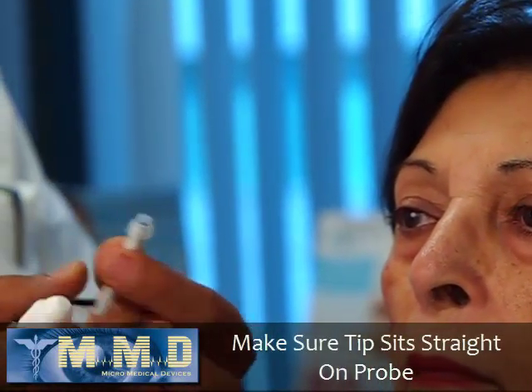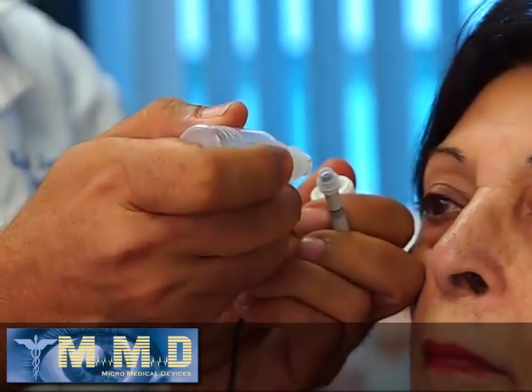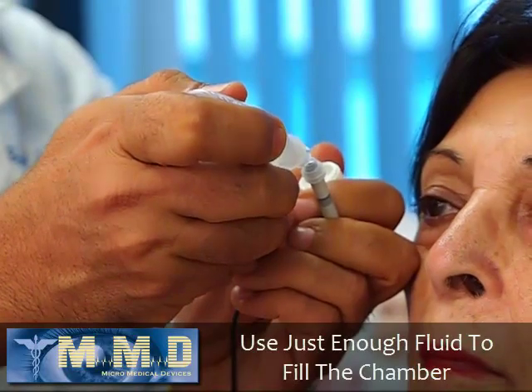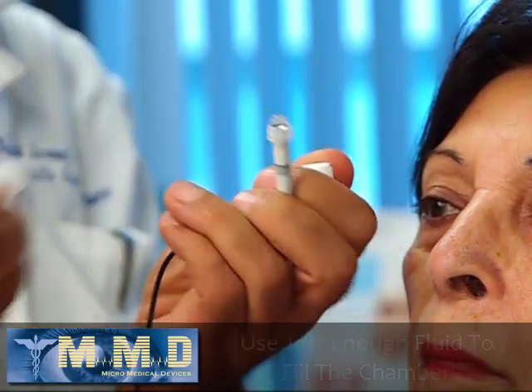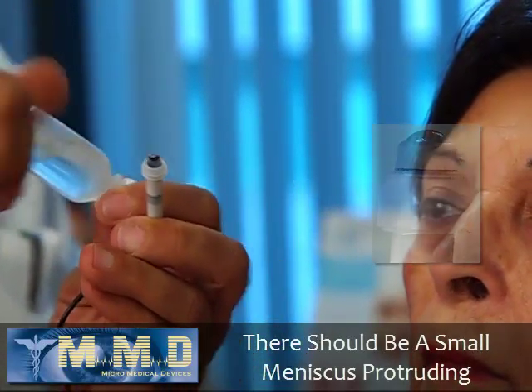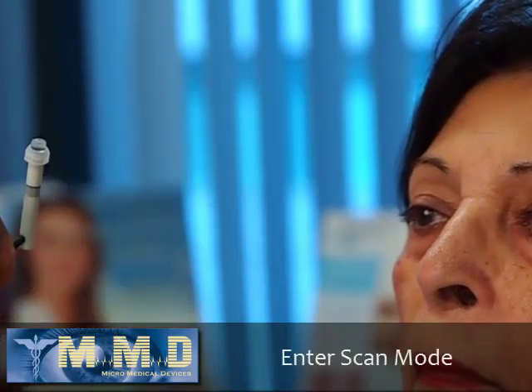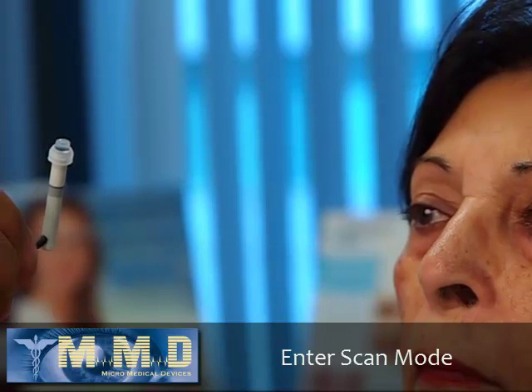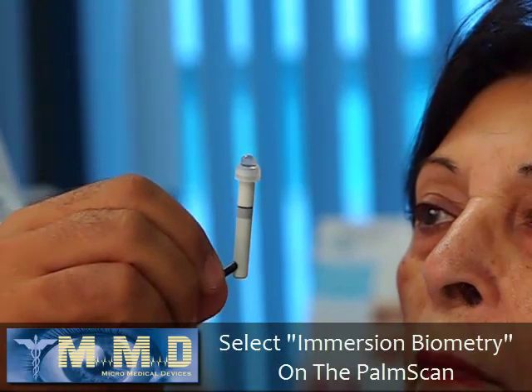Now we're ready to start the examination. I fill the Easy Immersion Tip with BSS by tilting it and placing just enough fluid to fill the chamber and form a small meniscus of water on top. Then I go into scan mode and make sure that Immersion Biometry is selected.